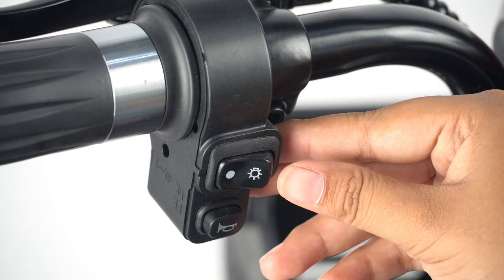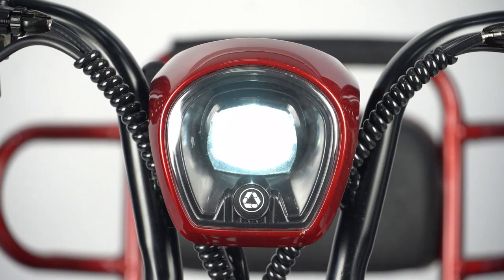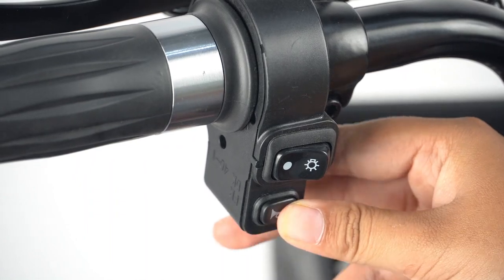Controls: Press the light button to turn on the light. Press the light button again to turn off the light. Twist the key further to turn on the light, and twist the key again to turn off the light. Press the horn to alert others.